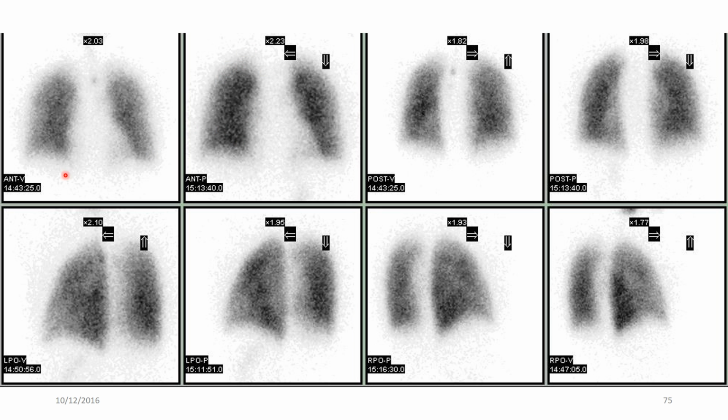So these images are anterior and posterior. So you've got ventilation anterior and anterior perfusion. So this is looking at the air supply to the lungs, and this is looking at the blood supply to the lungs, ventilation, perfusion. And so we use radioactive krypton gas or xenon gas, and the patient inhales it, or a radioactive vaporizer, essentially. Or a nebulizer, not vaporizer. That's something completely different. And that looks at how well the lungs ventilate.